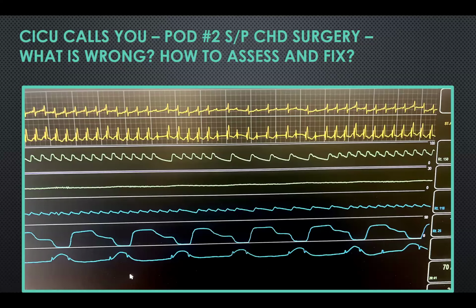But I don't know, what is the pacemaker here set to? What kind of mode? This patient is programmed DDD with a lower rate of 150. So it looks like when it's capturing or working, you have a rate of 150, and then when you're not getting the QRSs, you are still trying to pace at a rate of 150. Right. So this is actually a nice example of how the pacemaker modality is augmenting the spike nicely. But we see, of course, as you astutely pointed out, Vlad, there is no QRS following each pacing spike.